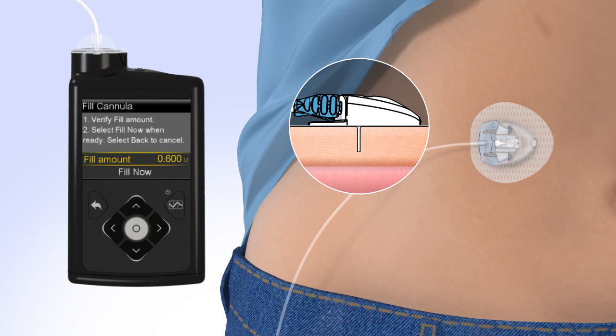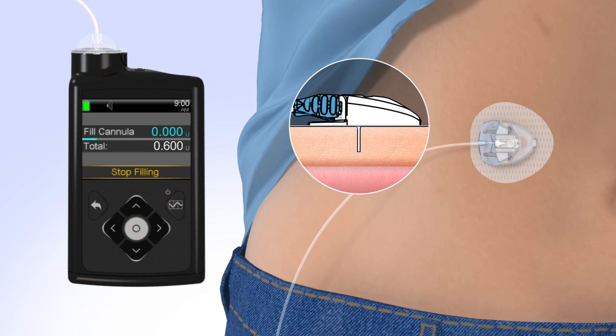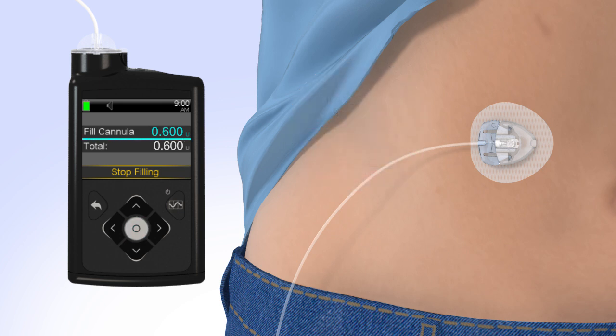If the amount is correct, press Down to Fill Now and press Select. The pump will begin to fill the cannula and display the amount. Congratulations! You have successfully filled your reservoir and changed your site.